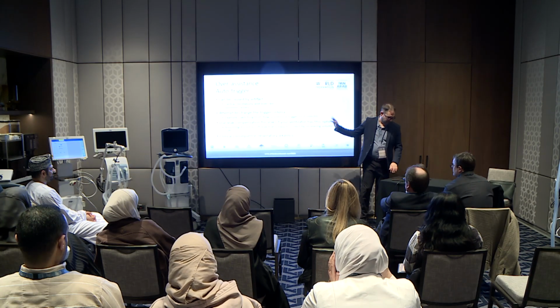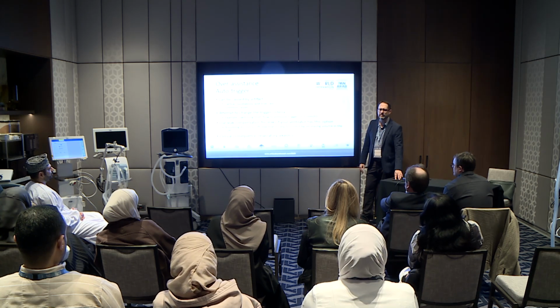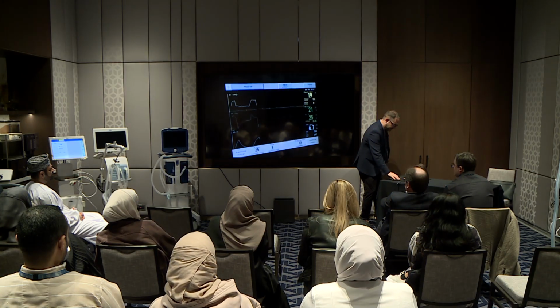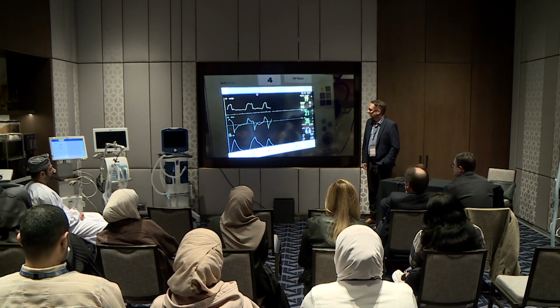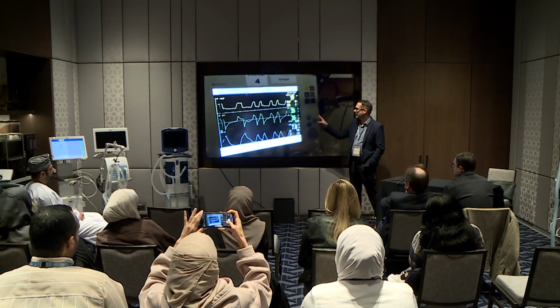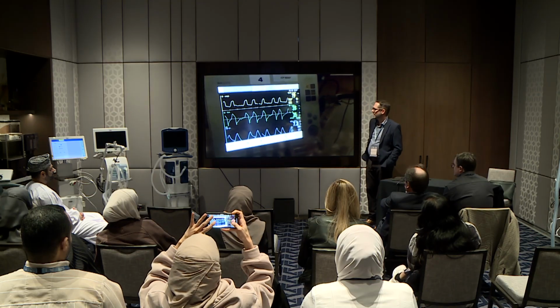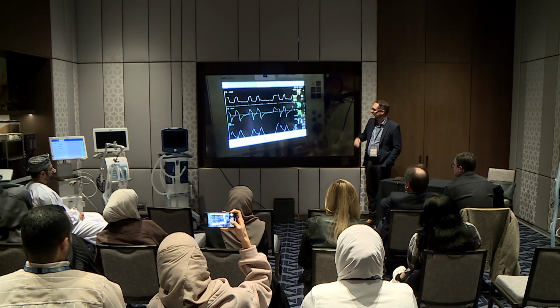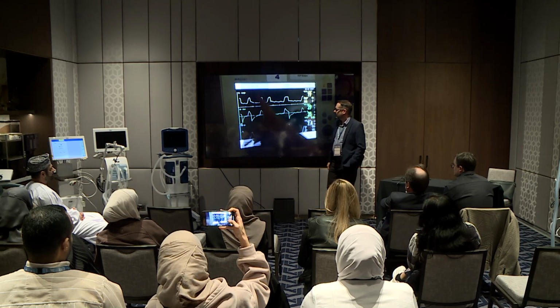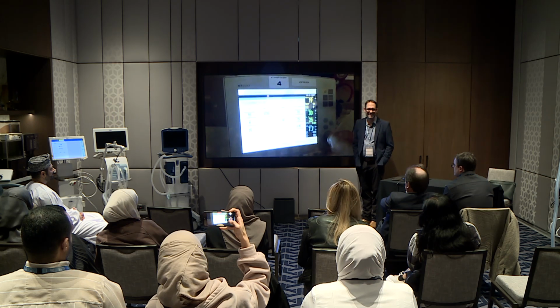I already talked about auto-triggering and the causes, so let's look at an example. Does anyone know how you would fix this? Before it shows you how to fix it, let's see if we can recognize it. So this respiratory rate was around 28. I had already fixed it and then I turned it back, and that's why the rate's going up. But it was around 28. How could I fix this? This is auto-cycling. You can see these pressure fluctuations and the flow fluctuations. The patient looks fast asleep. I'm about to fix it, so you're going to know the answer.